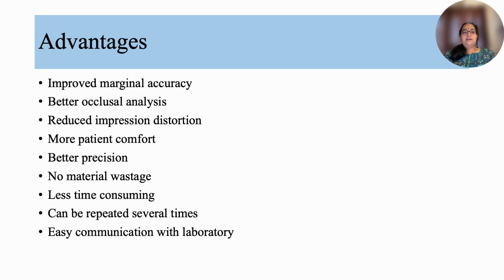Moving on to the advantages, there is going to be improved marginal accuracy, better occlusal analysis, reduced impression distortion, more patient comfort, better precision, no material wastage or usage, less time consumption, the scan can be repeated several times, and it is easy to communicate with the laboratory.